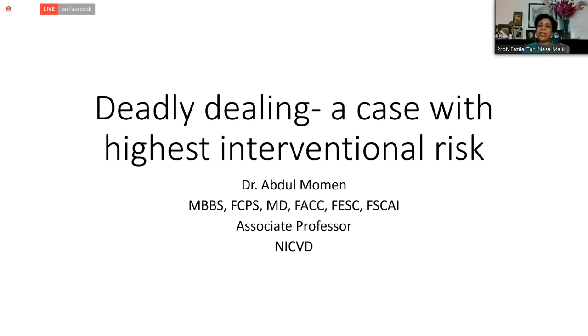Zero contrast is indeed a very topical issue nowadays and really does help our patients who benefit from minimum dye. Maximum we use around 20 ml, right? And the IVUS is a great tool for zero contrast.